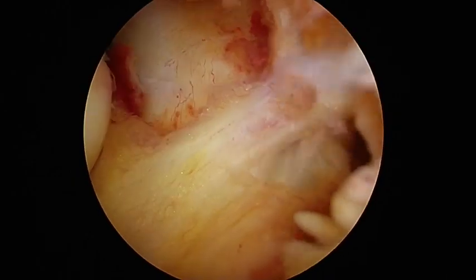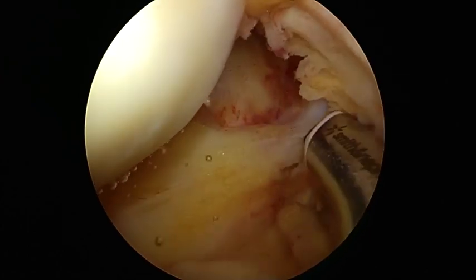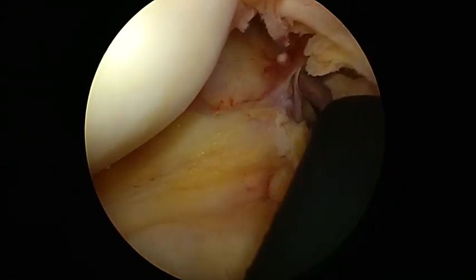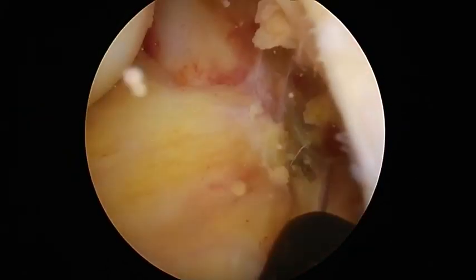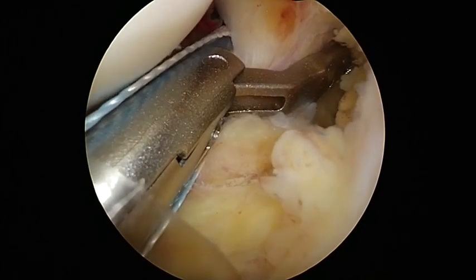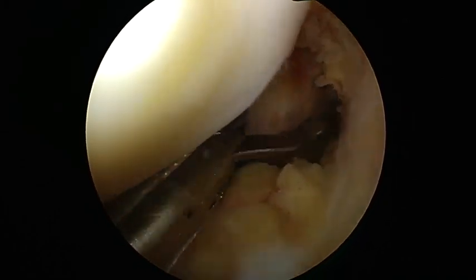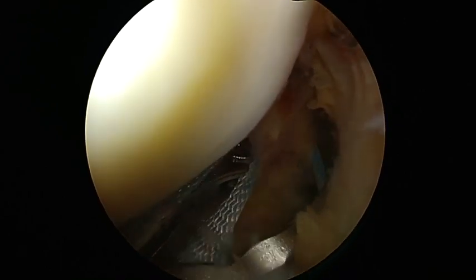For the pullout technique, the tibial bone tunnel area is cleared using a shaver or radiofrequency system from the low posteromedial portal. If fracture displacement is significant, debris from the fracture site is also removed. The suture tape is sutured to the PCL using a suture passer from the low posteromedial portal. In this case, we used a cinch stitch suturing.